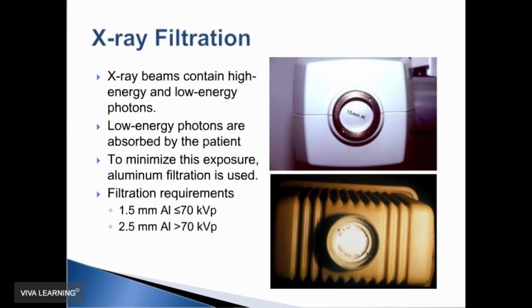Another safety feature that's inherent in X-ray machines is filtration. Beam filtration removes the longer wavelength X-rays that don't contribute to image production, but rather would be absorbed in the soft tissue.